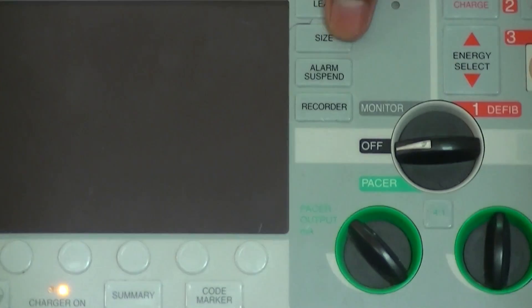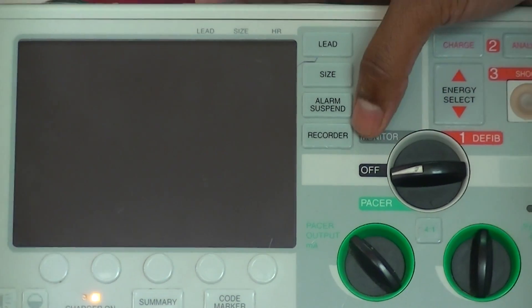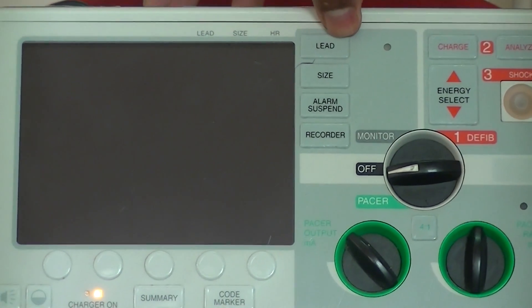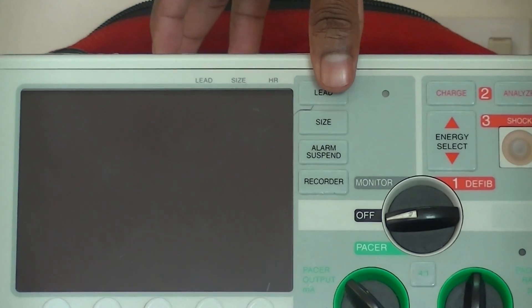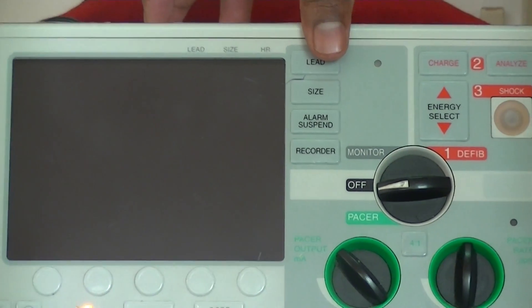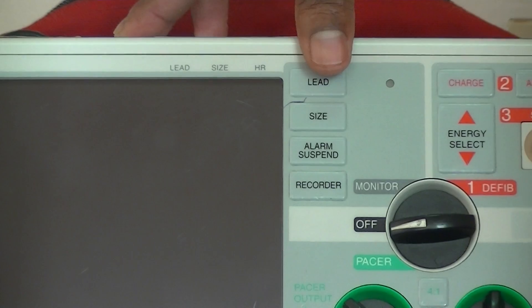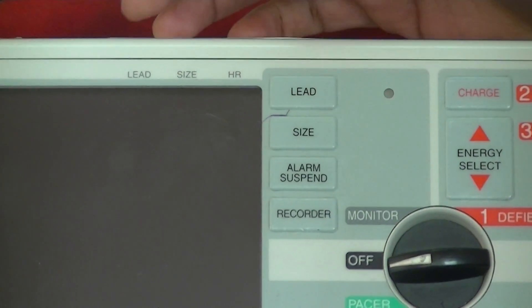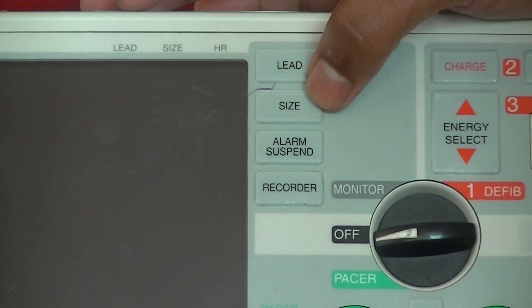Near the screen, you can see 4 soft keys which indicate the leads, where you can select your leads: Lead 1, Lead 2, Lead 3, AVR, AVL, AVF, V1 to V6, plus the paddles mode. When you want to change, you can use this leads selection.